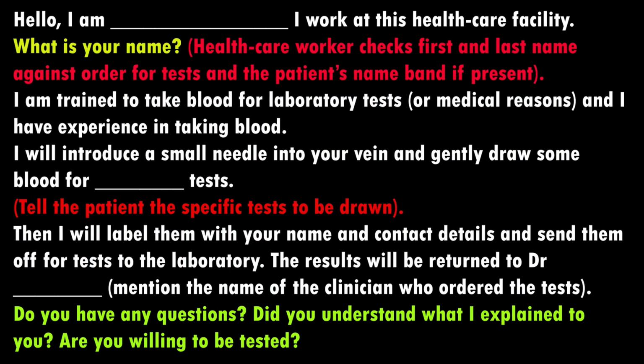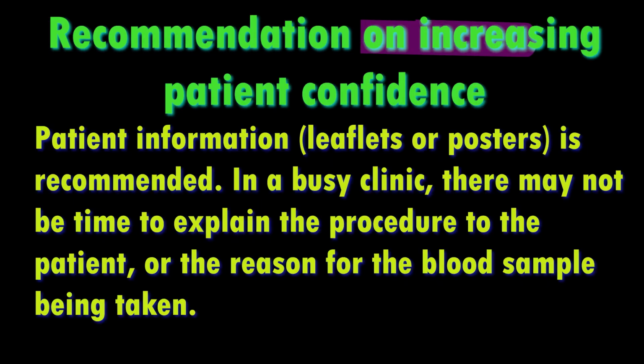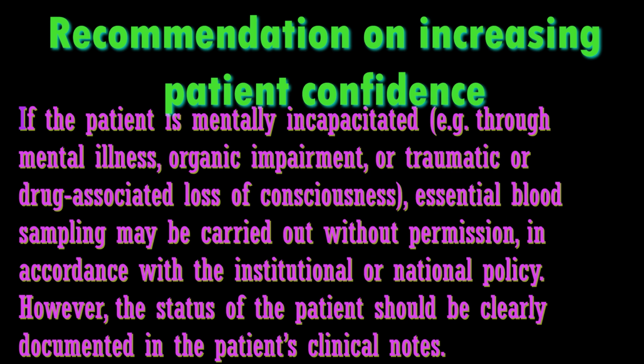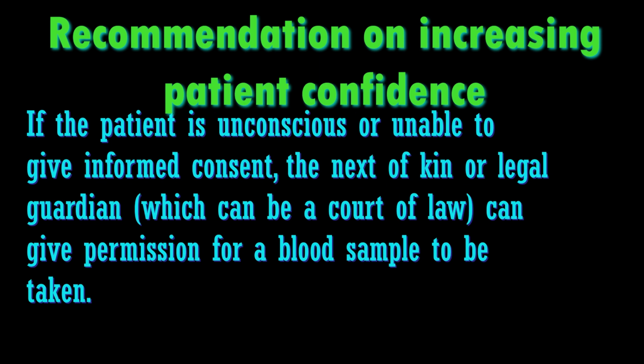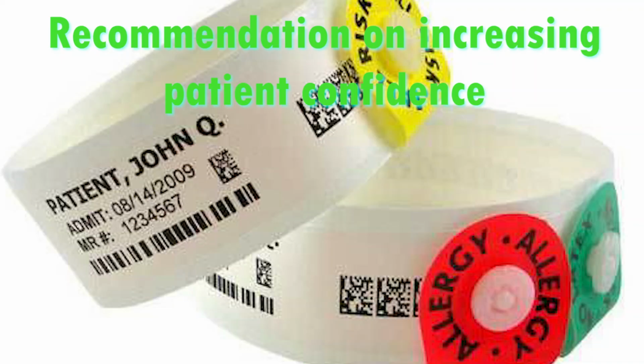Patient comfort. First, introduce yourself and make the patient comfortable, and ask whether the patient has allergies, phobias, or has ever fainted during previous injections or blood draws. If the patient is anxious or afraid, reassure the person and ask what would make them more comfortable. Make the patient comfortable in supine position if possible. Discuss the test to be performed and obtain verbal consent. The patient has the right to refuse the sample collection.